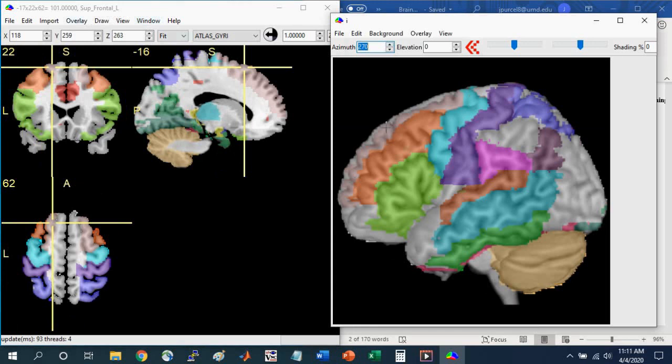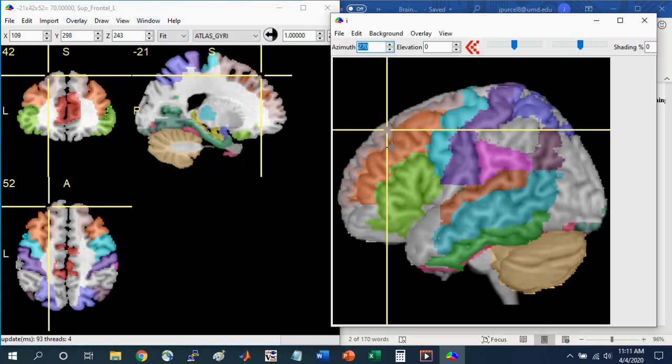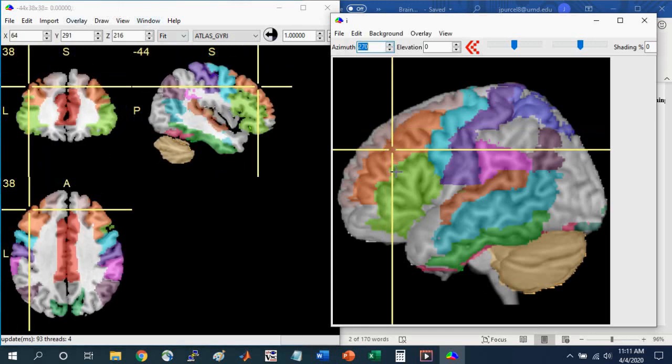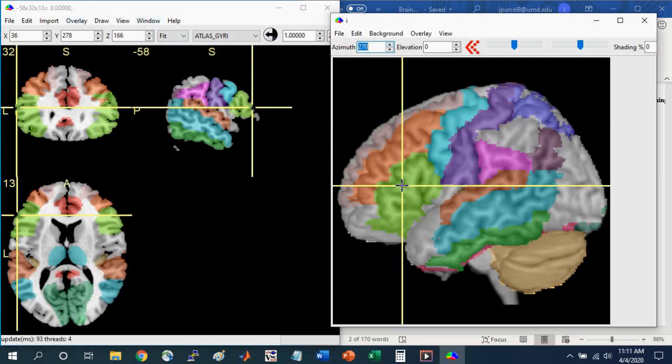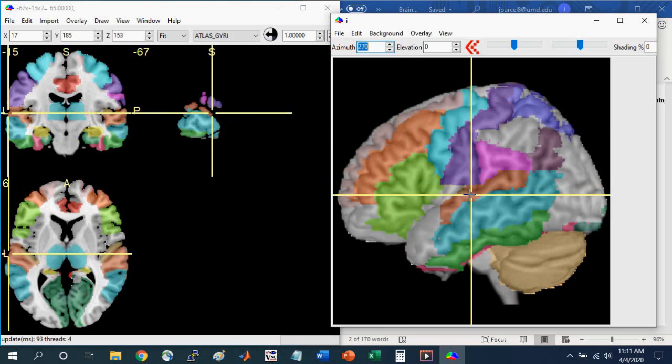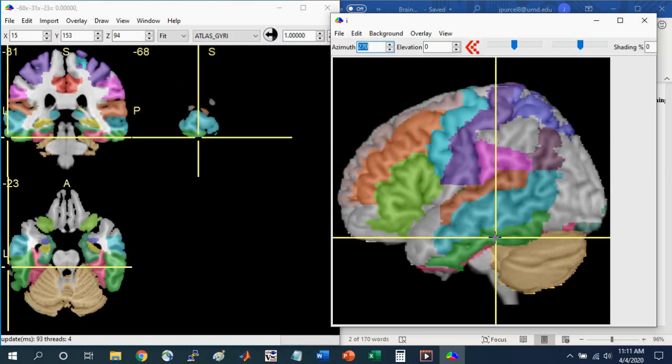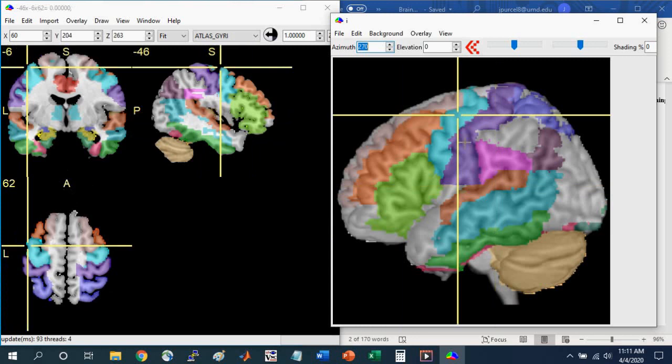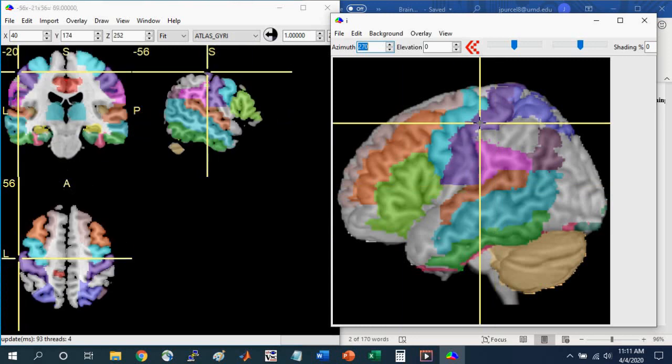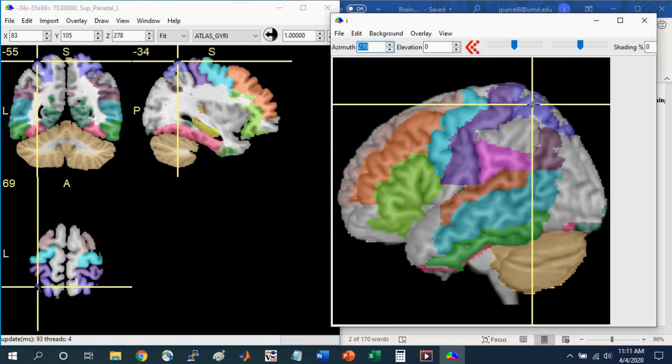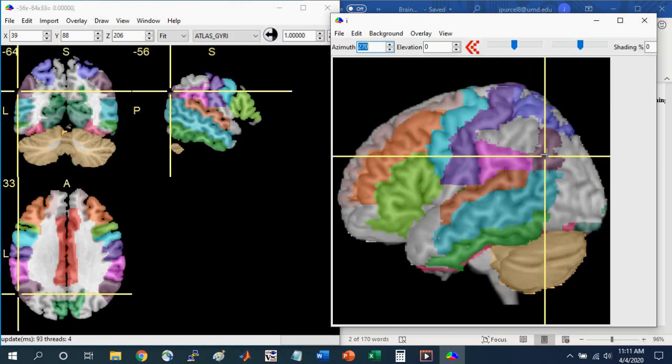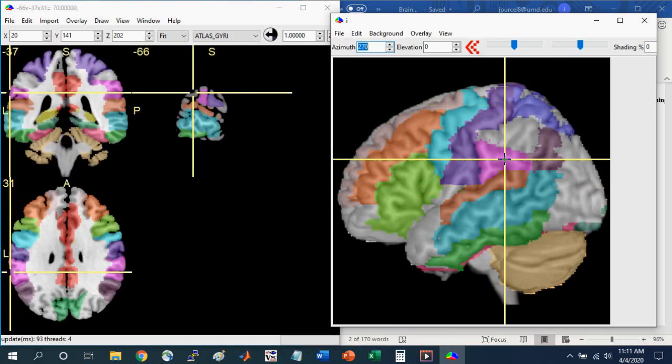You can see the superior, middle, and inferior frontal gyrus. You can also see the superior, middle, and inferior temporal gyrus. You can see the precentral gyrus and the postcentral gyrus. You can see the different anatomical structures in the parietal lobe, such as the superior parietal lobe, the angular gyrus, and the supermarginal gyrus.